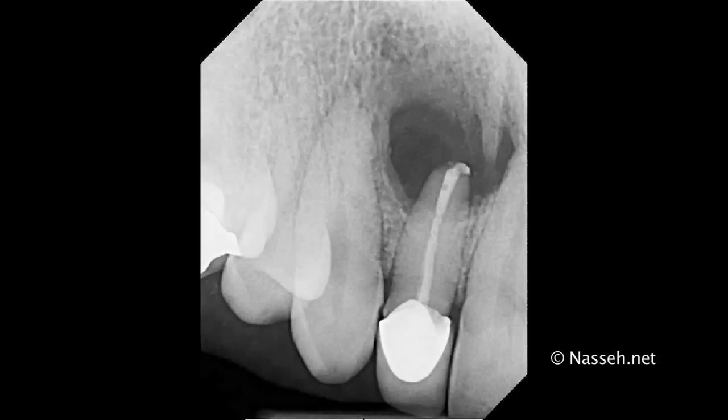As you can see, this is the immediate post-op of the case. The retrofilling is done using the EndoSequence bioceramic root repair material only. My new technique that I've developed, as you have seen in previous tutorials, includes first placing the retrofilling material and then the root repair material, and then following that up with a cone of putty. But here, this is one of the earlier cases I have done where I used to fill the entire retrofilling with the root repair material only without the use of any putty.